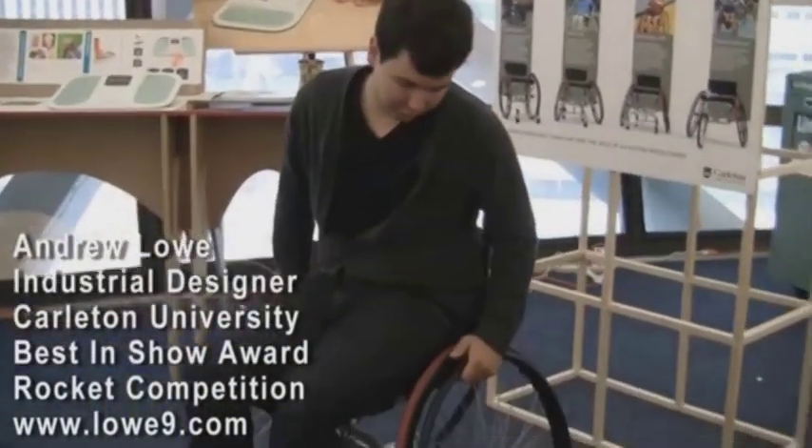Hello, my name is Andrew Lowe. I'm a student at Carleton University and this is my thesis project, the Cross Trainer Wheelchair.